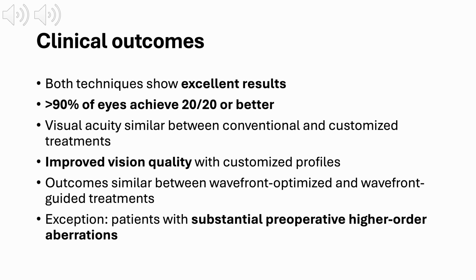When Wavefront-optimized and Wavefront-guided treatments are compared directly, overall outcomes are also quite similar for the average patient. This is an important point. Wavefront-guided treatment is not automatically superior for everyone. The key exception involves patients who start with substantial preoperative higher-order aberrations.